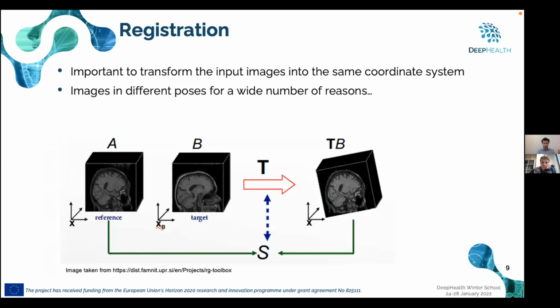Registration, as mentioned before, takes a reference image, it takes a target, and tries to apply some rigid transformation with some noise cleaning and some standard pre-processing techniques to the data in order to put it always in the same pose. This helps the traditional algorithms towards some robustness.